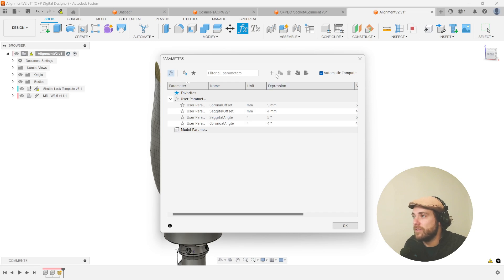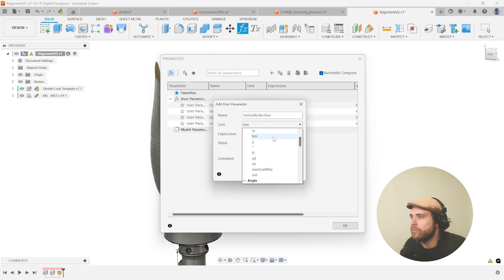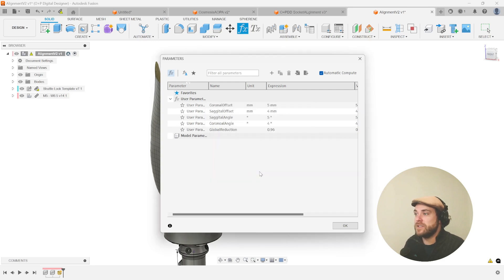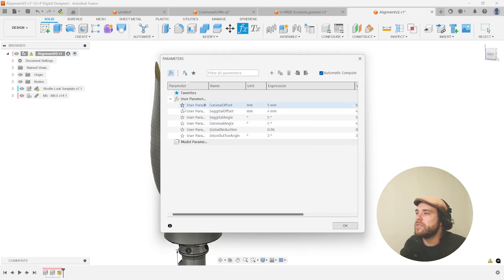The coronal angle will be in degrees — let's give it four. Then we can do one for the global reduction, which is a regular real number with no units, expression of 0.96 — that's around a four percent reduction. We also have the into/out angle: let's call this the into/out angle, set to degrees with an expression of three. So there are our user-based parameters.